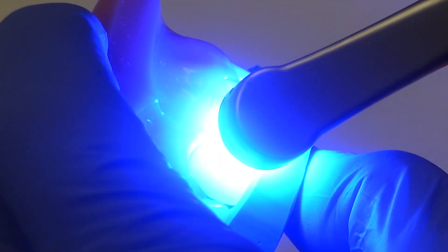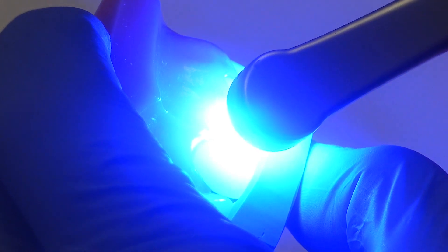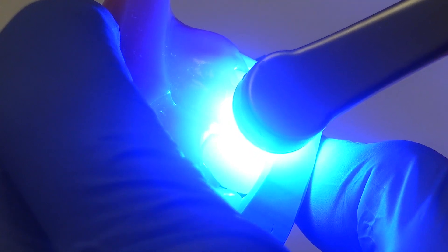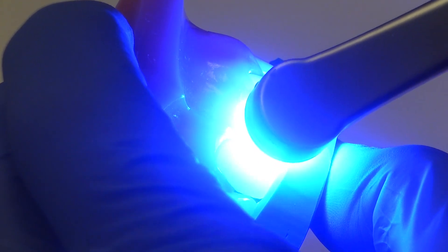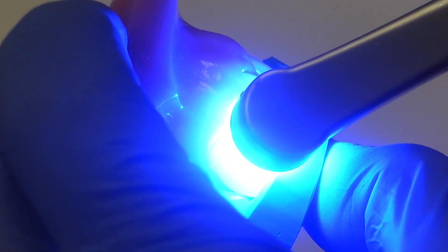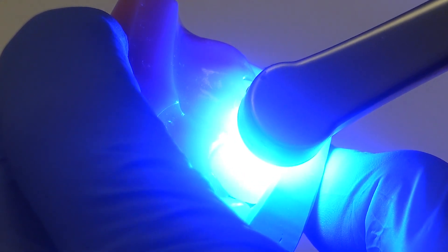That's going to be a lot more difficult if there's a bulk of material in the proximal at this point. When you cure the material, because some of this might be curing through the tooth — in this case we're not behind the lingual surface, but sometimes we are — that would be a time when you'd want to double the amount of curing time, whatever your light takes to set it. Not necessarily to fully cure it, but to set it — just double that when you do the template.